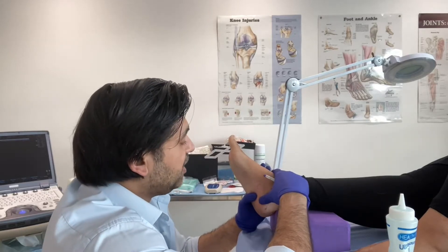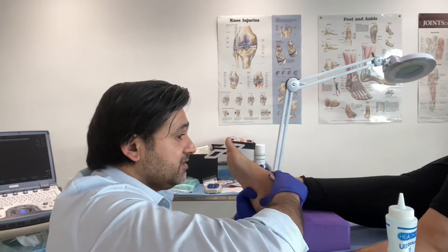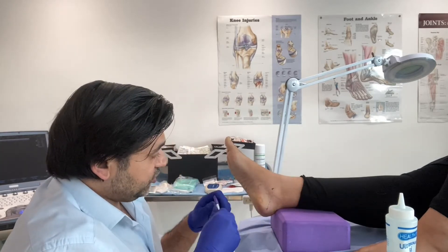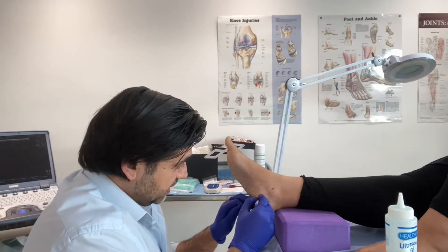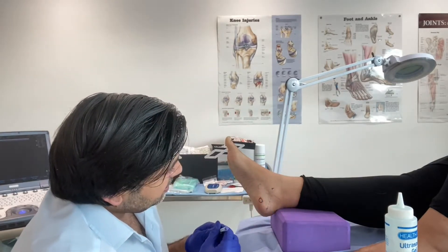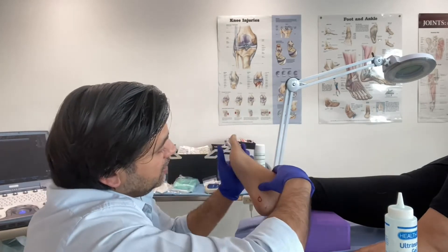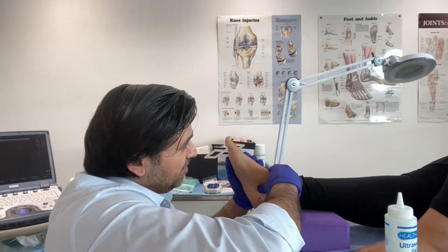So we've got two areas of pain. This first pain — does it hurt just there? Yeah. The medial tubercle, the calcaneus — let's mark that out again. Then we've got a burning sensation that starts around the medial ankle, comes into here. Does it hurt there? Yeah.